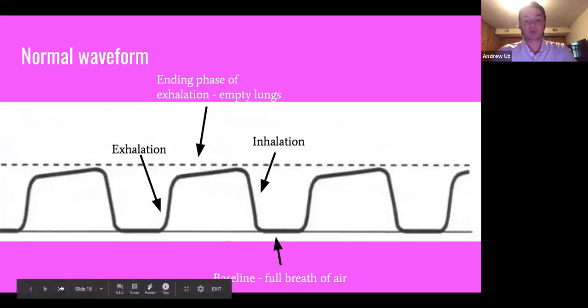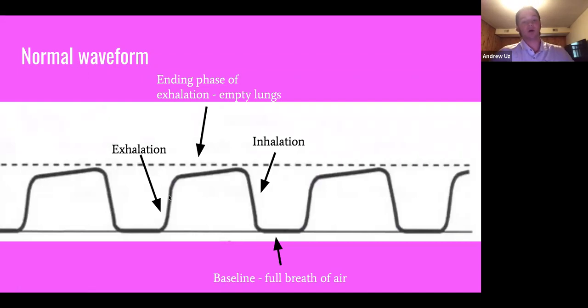So what we're looking at here is the waveform of how this CO2 is coming out. Like I said, picture it as if we're looking at the readout of the exhaust, and it's kind of contradictory to what would be intuitive. A lot of people would think that the spike and then the plateau is a breath in.